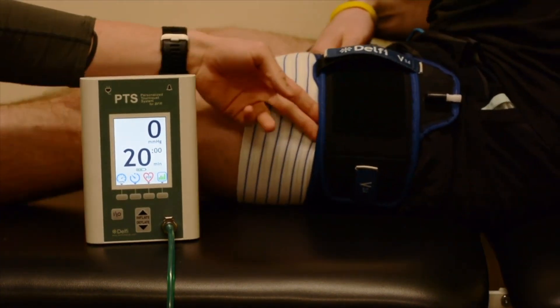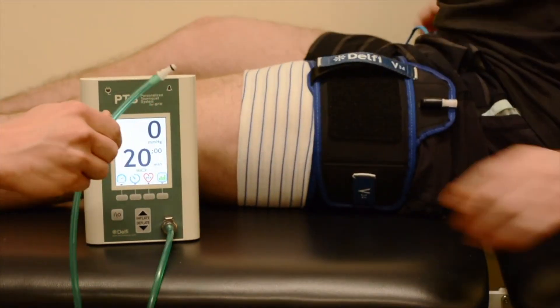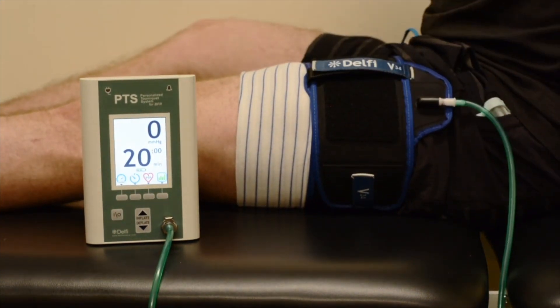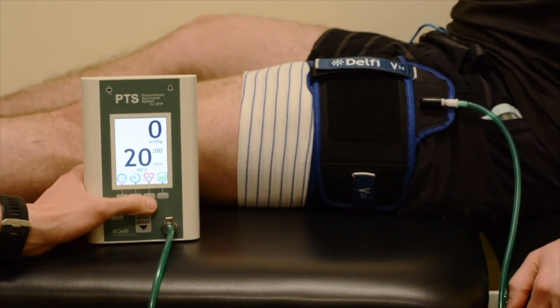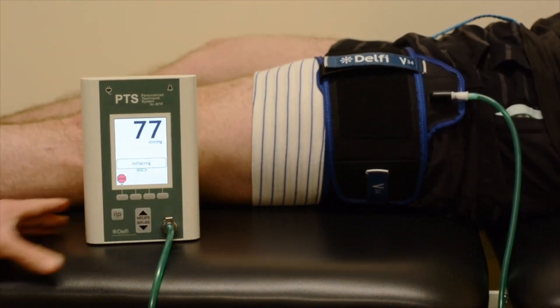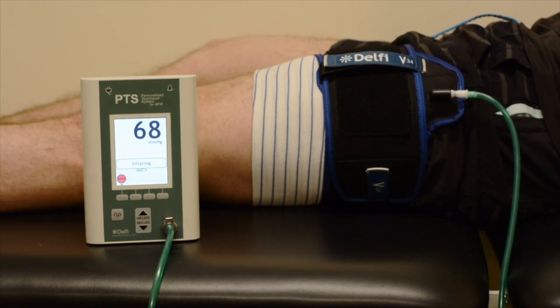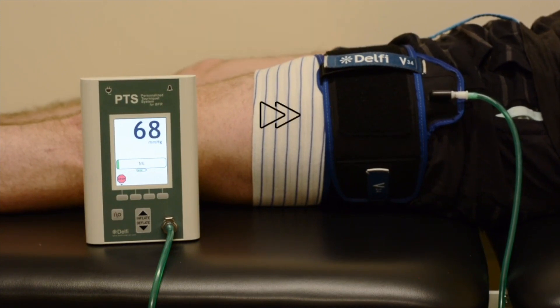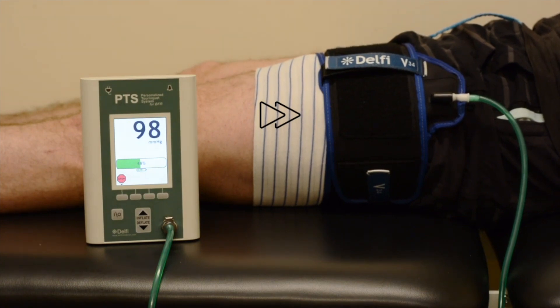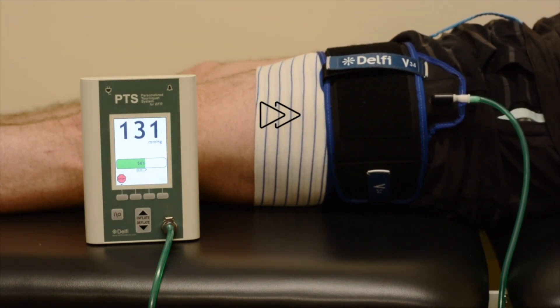Connect the personalized tourniquet system to the cuff using the hose assembly. Instruct the patient to lie on their back and press the PTP multi-function button. The cuff will then inflate and begin measuring the limb occlusion pressure, or LOP. During this phase, the system is determining the minimum pressure required to stop the flow of arterial blood.